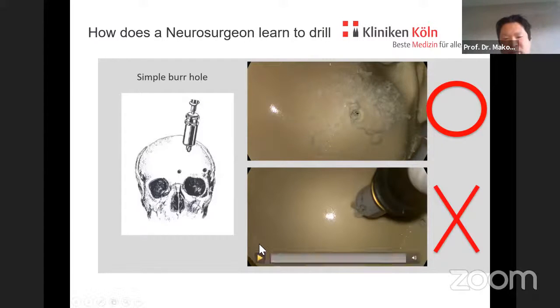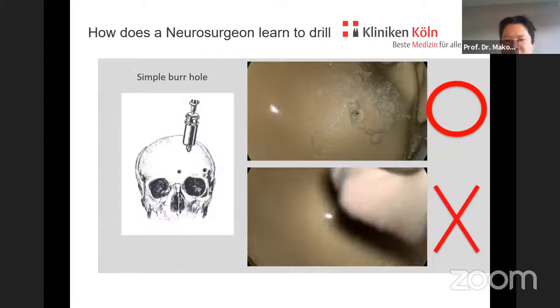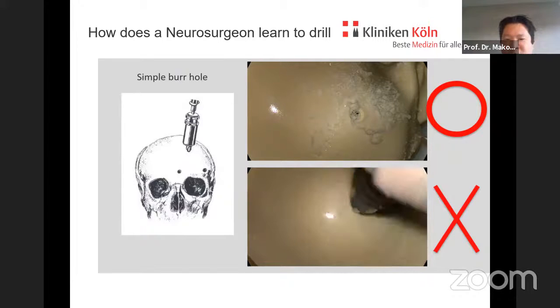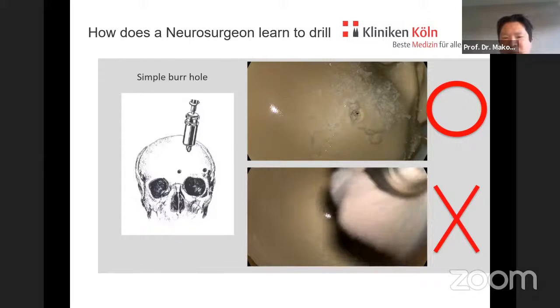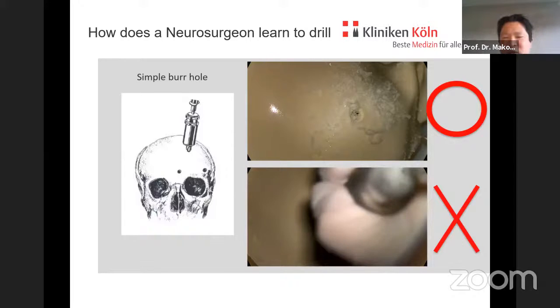It's a little bit exaggerated video, but sometimes you see this, rounding movements, here done intentionally. The device is not developed to be used like that. If you use the device in this manner, it can easily happen that you tear the dura or the releasing system doesn't stop. So this is very basic stuff, but important for the system to work properly.